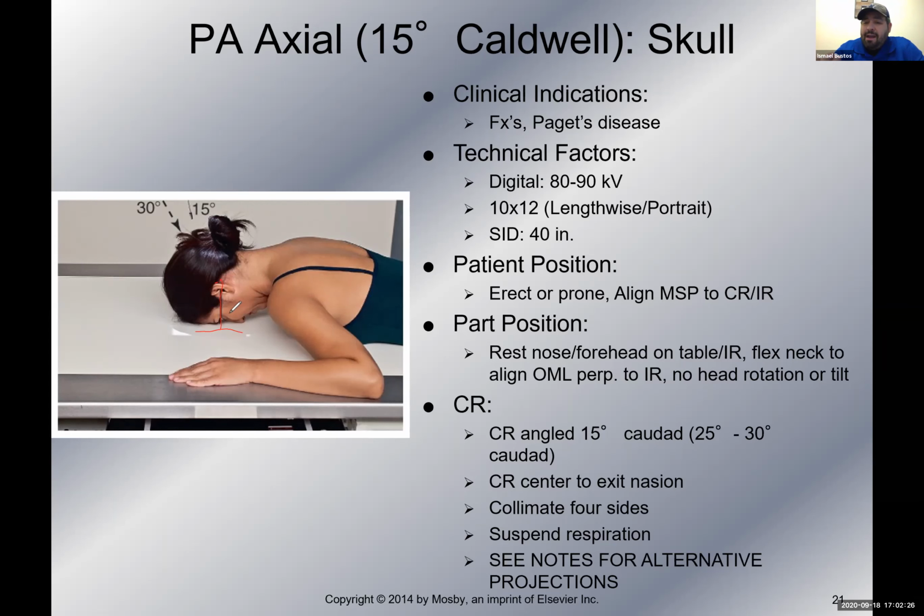And we're going to angle the CR 15 degrees caudal. If you look here, this first one, it's 15 degrees caudal. It needs to be 15 degrees caudal from the OML, which is here. So we're looking primarily at the relationship or angle between the CR and the OML. That needs to be 15 degrees. That's going to give us the Caldwell projection.